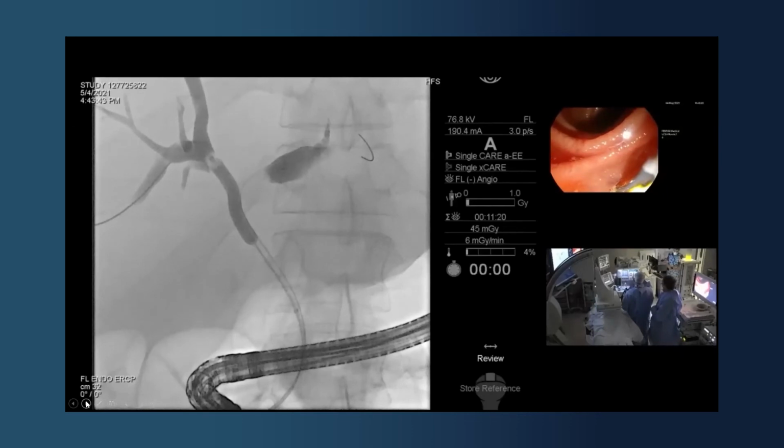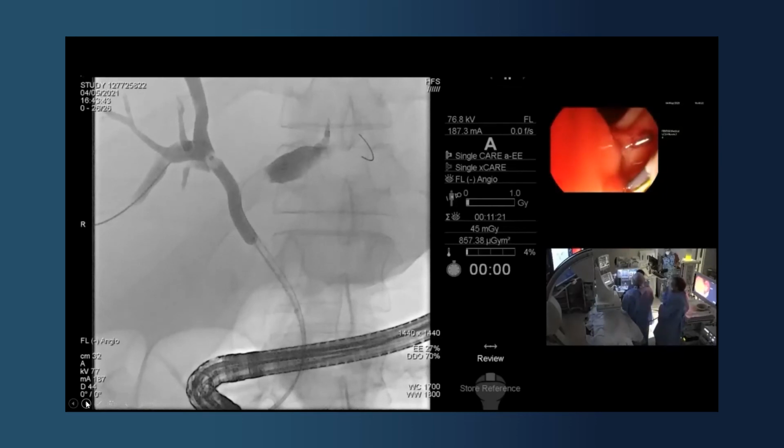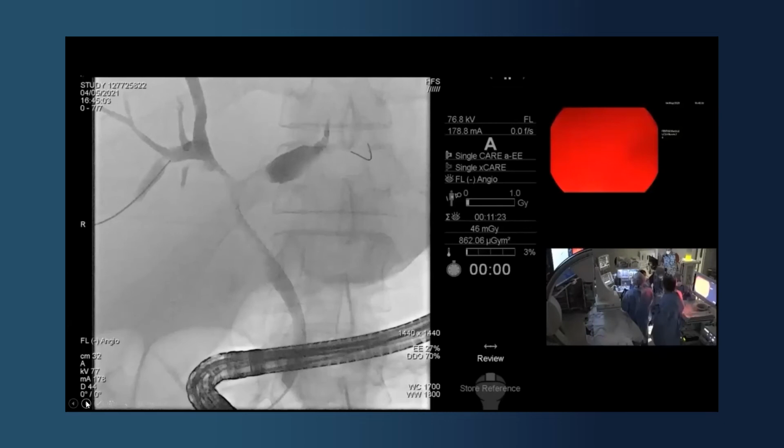Let's hold that. I think we will dilate the left as well, Simon. There's no right or wrong, but we don't want to find that you get in there and you can't get it round the corner. Okay, well, let's dilate the left, and then hopefully we just stent. That means that we have absolute confidence that we are not going to lose the wire.